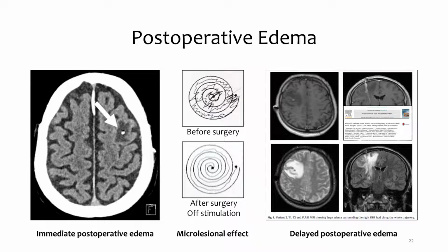I should also mention edema. The mere introduction of an electrode into the brain will often create a small visible edema. This is sometimes noted as a so-called microlesional effect, and then most often as an improvement of the patient's symptoms, but in a few cases as a minor adverse effect, most often affecting the speech. Positive as well as negative effects will resolve with the edema within days or weeks. Large and symptomatic so-called idiopathic delayed onset edema are rare but have been described, appearing days to months after the operation, and spontaneous recovery is expected, but steroid treatment might be indicated.